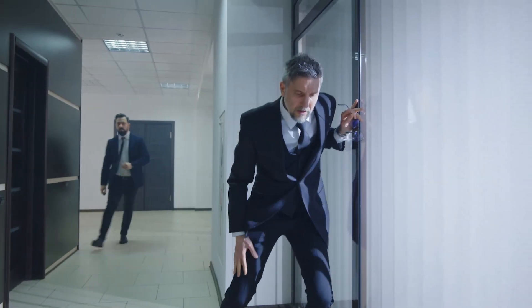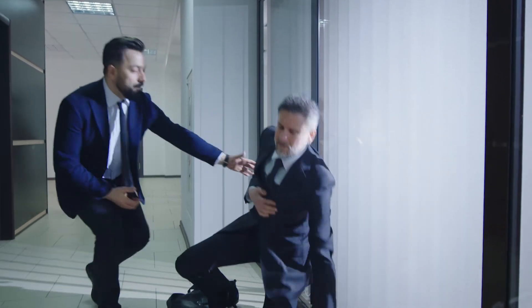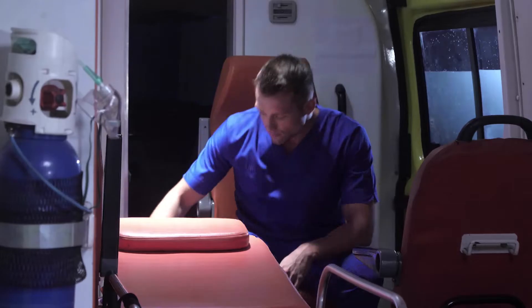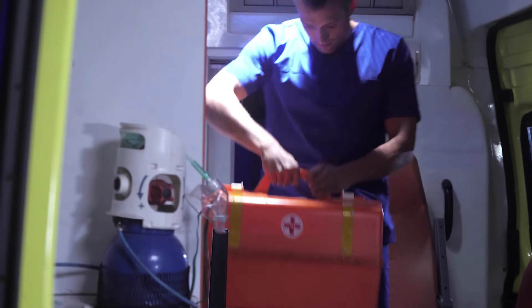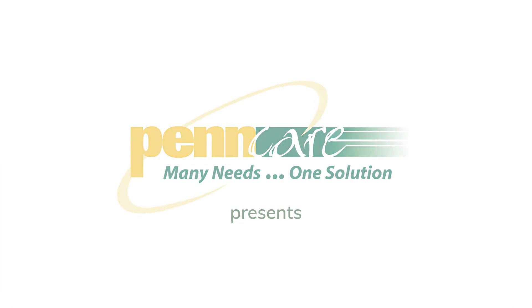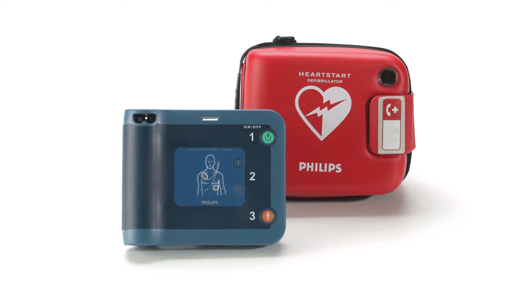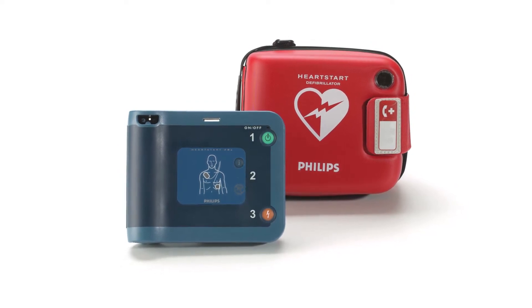Sudden cardiac arrest claims 350,000 American lives every year. When every second counts, first responders need the most reliable equipment to do their job. PennCare presents the Philips HeartStart FRX, a rugged and dependable automated external defibrillator designed with the first responder in mind.